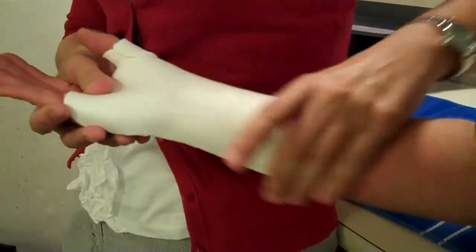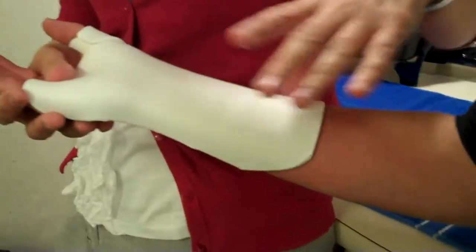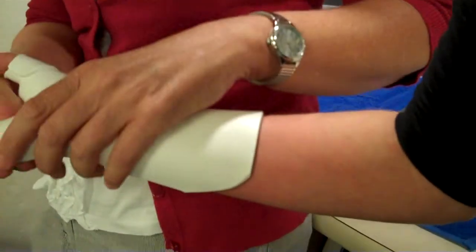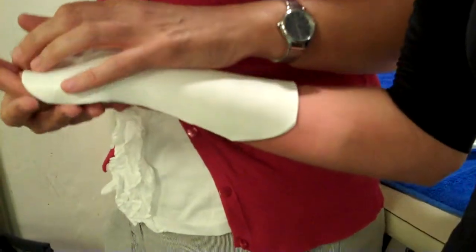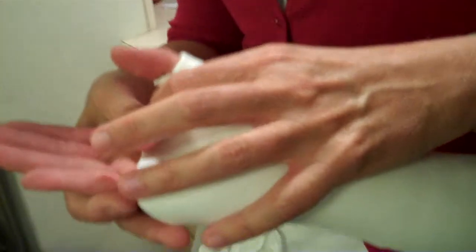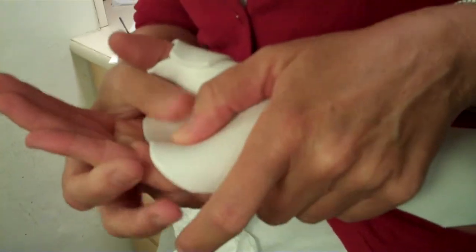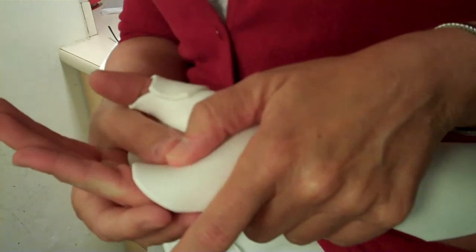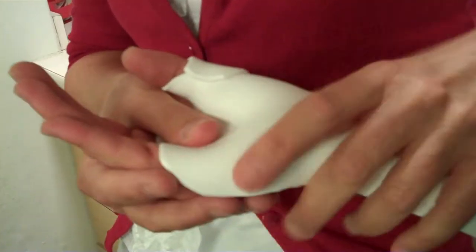I'm really, see, this is a very rigid material, so I'm working with it. I'm really handling it. I'm sorry. It's going to blister. Thumb is kind of cupping, like in the distal crease. Is that where the transverse is? Is that where you're holding your thumb? Yeah, I'm kind of holding my thumb in there, in that distal transverse crease. I'm going to have to either fold this guy back or cut him because it's too long for her.